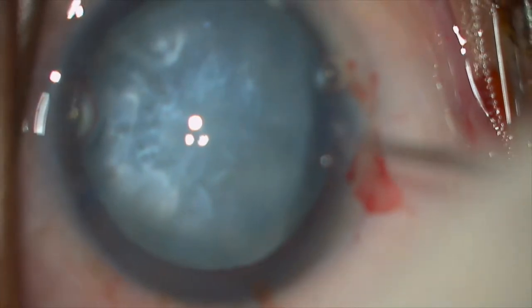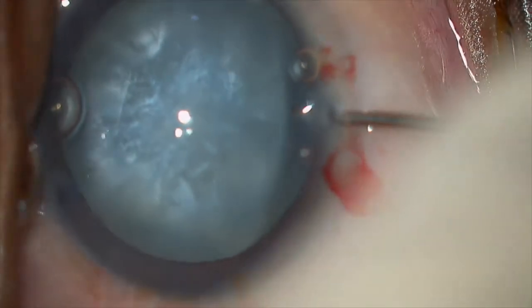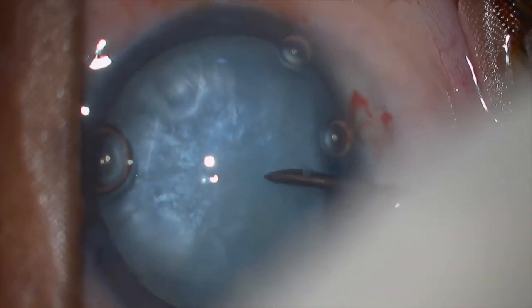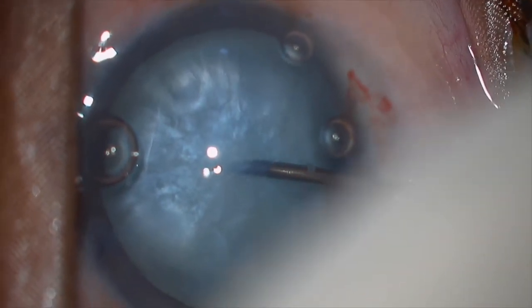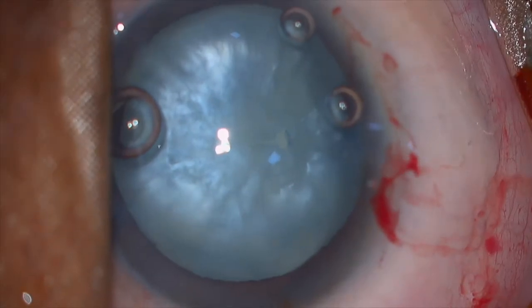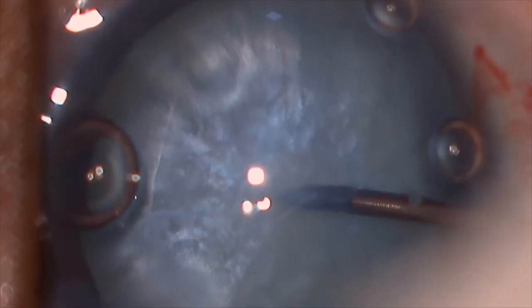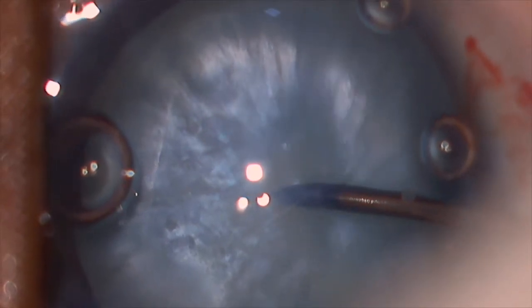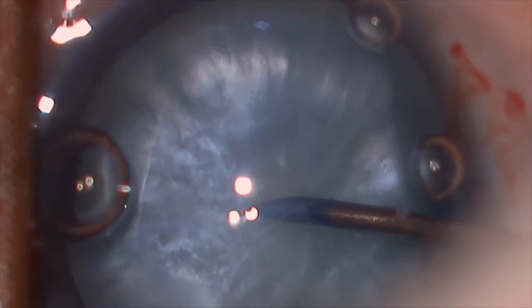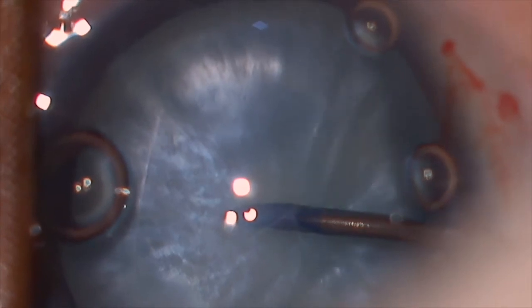The scariest cataracts are the intumescent cataracts where the intralenticular pressure is very high and the chances of extension are maximum even after the first nick. As you can see, the liquefied cortical matter is being aspirated through the 26-gauge needle slowly and gently. This simple step ensures the intralenticular pressure is brought down drastically and the chances of an Argentinian flag sign are almost nil.